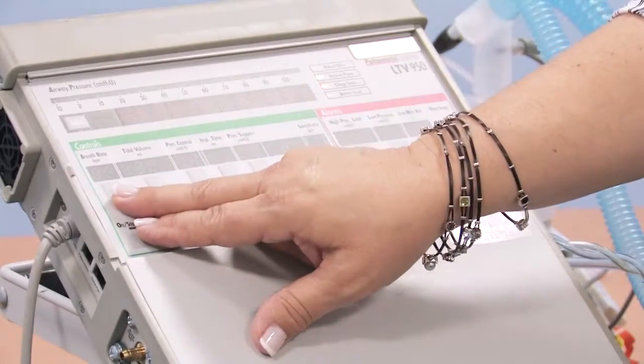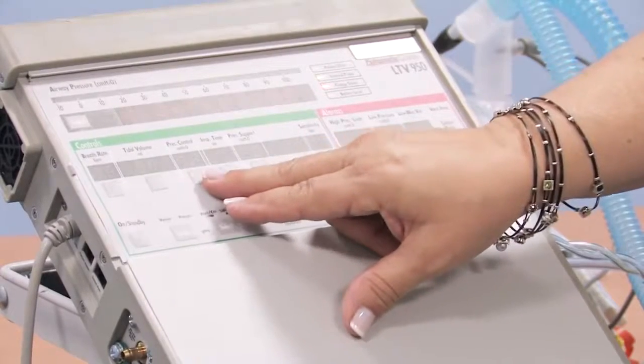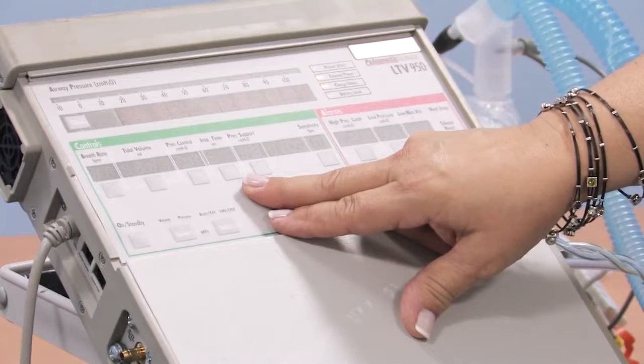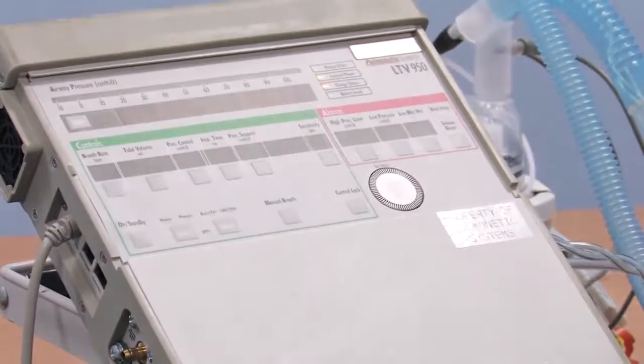So we've talked about breath rate, if ordered, how many breaths, and what kind of breaths they are. The breath has to be blown in over a certain period of time. If the machine's going to blow a breath in, it wants to know how long you want it to inhale into your child's lungs. Just like when you squeeze the bag and give your child breaths, we say 1/1000, 1/1000, 1/1000. If your child is a small infant, they may breathe faster and you may squeeze the bag faster to keep up with them. If they're older, they might breathe slower. But the machine needs to know how long we want them to blow in.